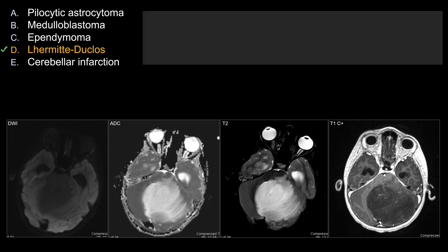On diffusion-weighted sequence and the ADC map, you can see that this expansile lesion has lots of areas of increased diffusivity — ADC value is high, so bright on ADC. There are also areas with relatively normal diffusivity compared to the adjacent tissue. Importantly, on diffusion-weighted sequence, you do not see an area of restricted diffusion. That's important because if you do see restricted diffusion in terms of a neoplasm, you should be thinking about something that is hypercellular.